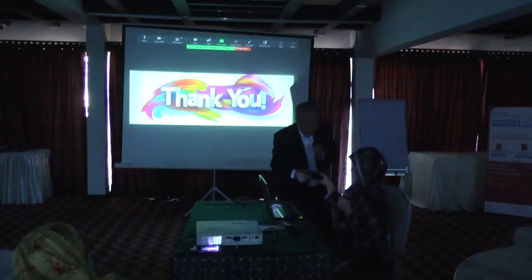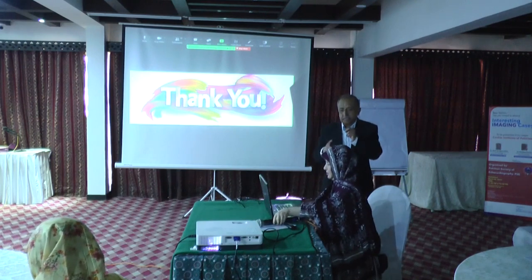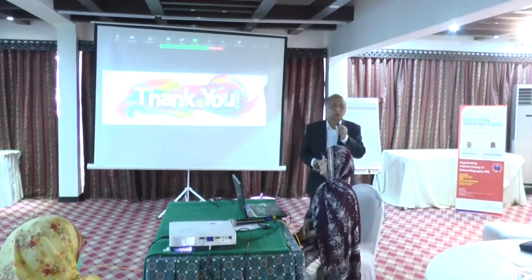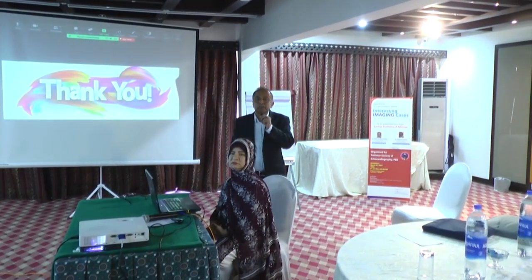So thank you very much, Dr. Lubna. It was really a nice case. मेरी आवाज़ मेरा ख्याल माइक के बगैर भी आ जाएगी, सिर्फ ऑनलाइन वालों के लिए माइक है. So it was really a nice case, and the usage or utility of multimodality imaging, जो कि यहाँ पर transthoracic echo पे initially the things were not clear, and then CT was done and it showed pseudoaneurysm.